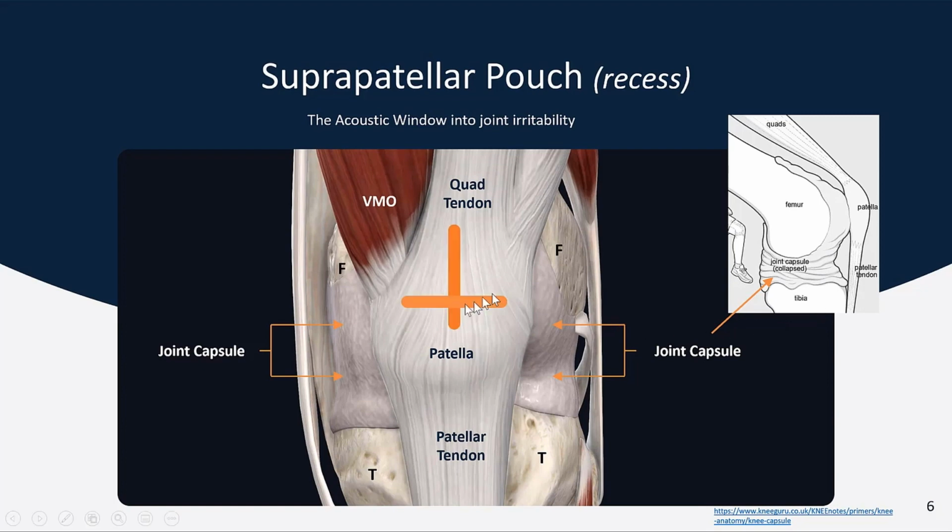We're going to be placing the probe vertically over the kneecap and horizontally over the kneecap to best identify how much fluid is actually in that capsule. Because if we can identify whether or not there's an inflammatory process intra-articularly, we can critically evaluate what part the diagnosis might have that involves that tissue.